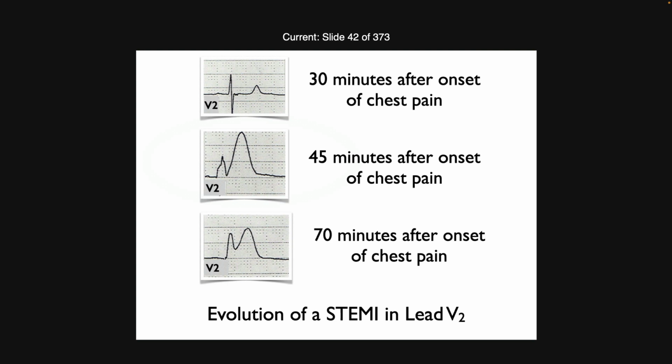And once you get to the hospital and the ambulance is juddering a little bit, that doesn't work either. But going down the road, no problem. If you have something that's changing, it doesn't hurt the patient. Price of ink, who cares? Even if you're doing other things, you just push it and it pops out.